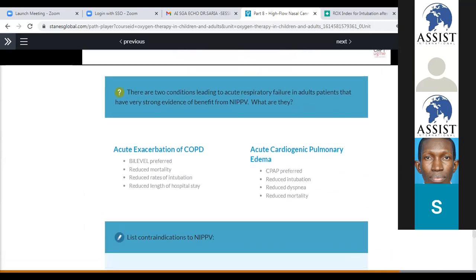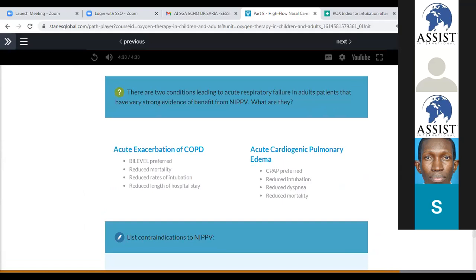So thank you for that video, Kevin. So as we have seen, we can have what is known as CPAP, we can have what is known as NIV or NIPPV sometimes.